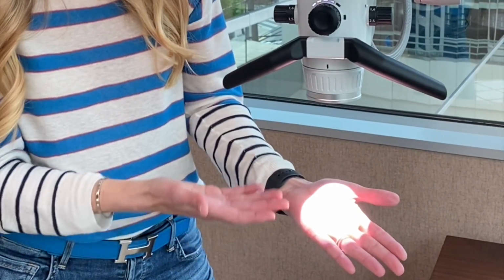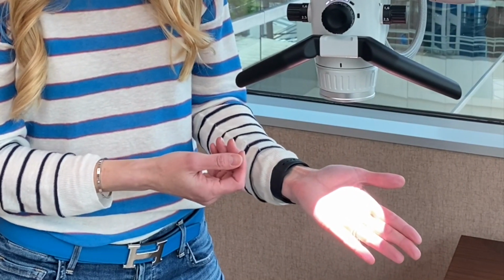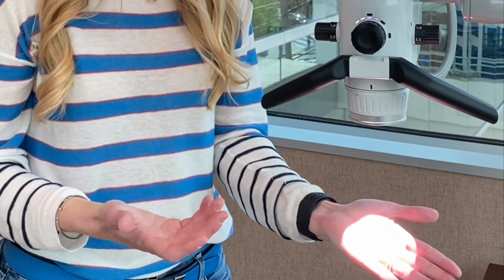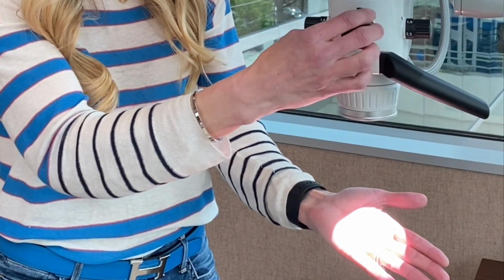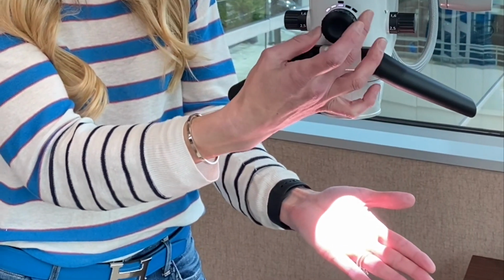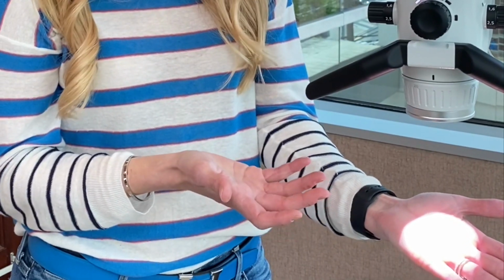This high intensity light source is an LED, and that's pretty much the standard today in dentistry. A lot of scopes over the years have had halide and halogen and xenon, and the challenge with them is that the bulbs burn out too quickly and you have to replace them frequently. So this is a really great advancement in more recent years with microscope dentistry. The intensity usually can be adjusted. On this scope here, there's a dial right in the middle, and you can dial it up or down to decrease that intensity if you need to.